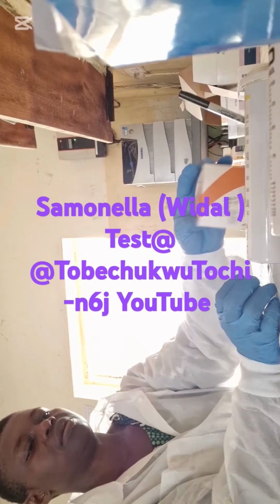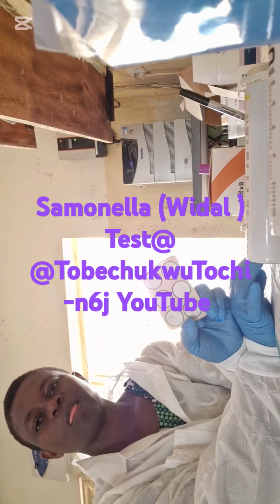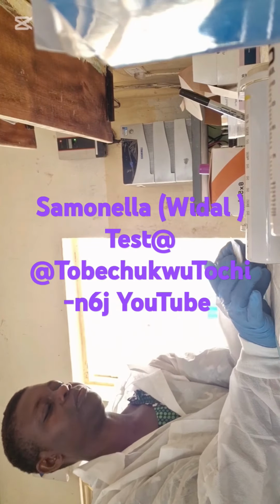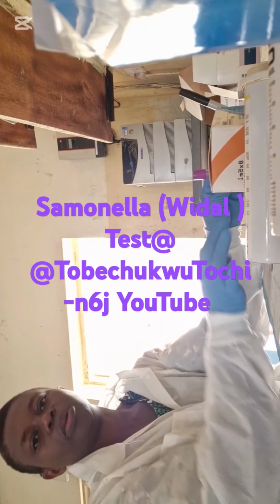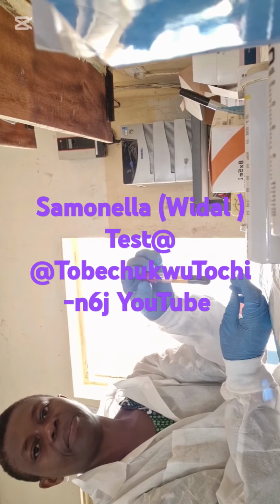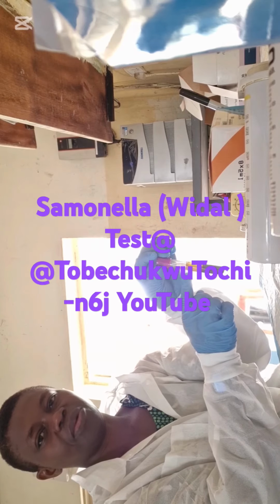As you can see, this is the kit. It's called anti-sera, that is Widal antigens. We have antigen OA, OB, OC, OD, and then HA, HB, HC, and HD.